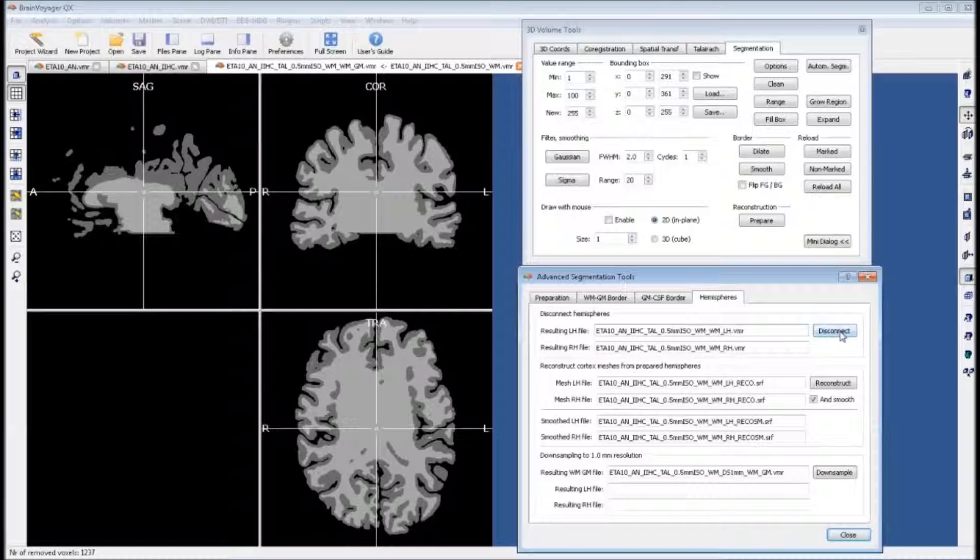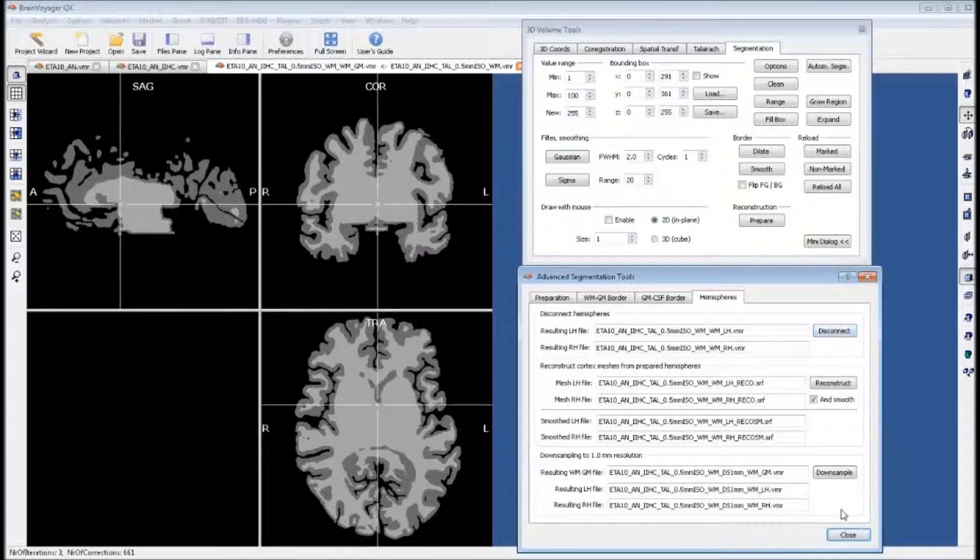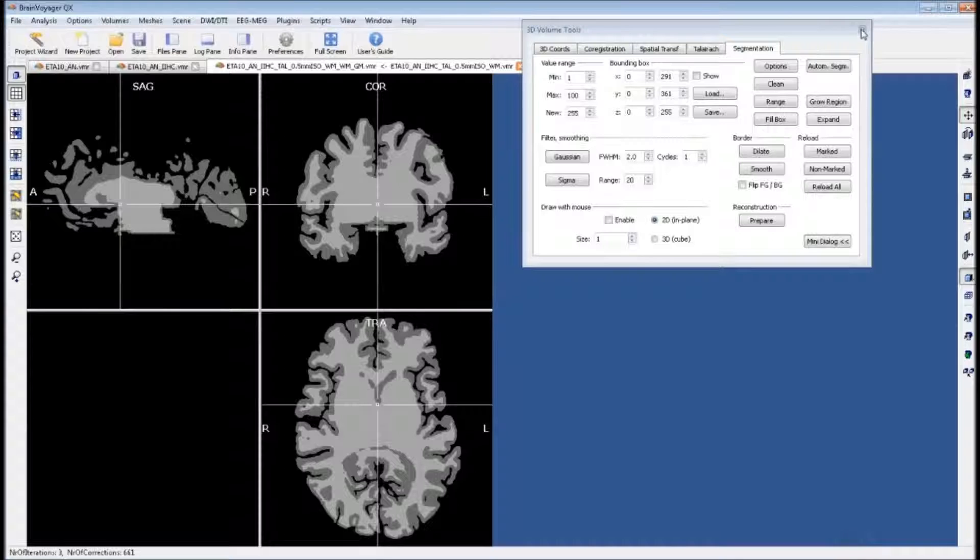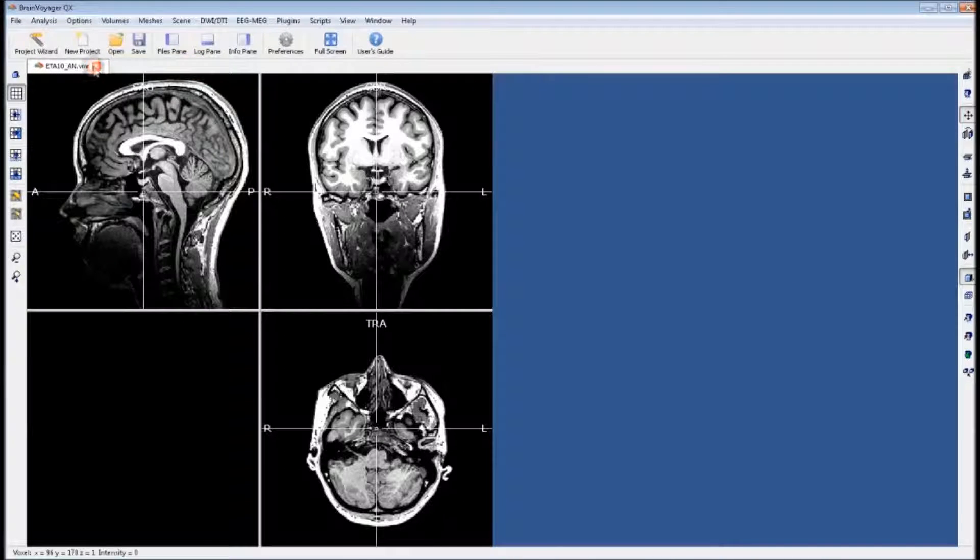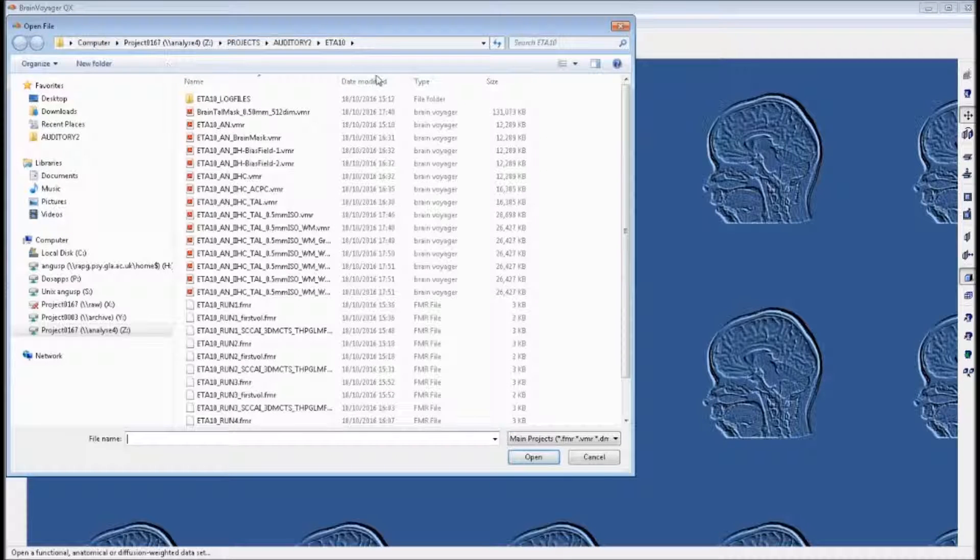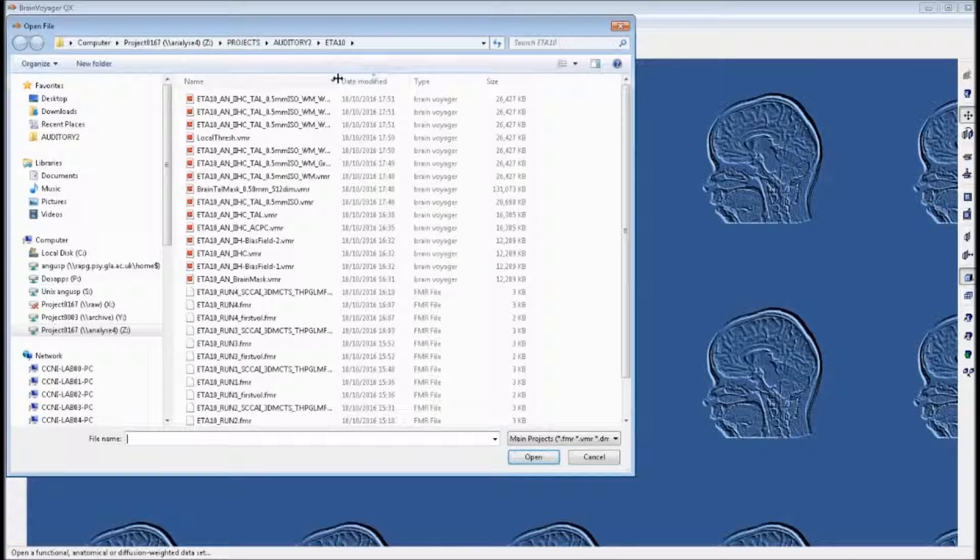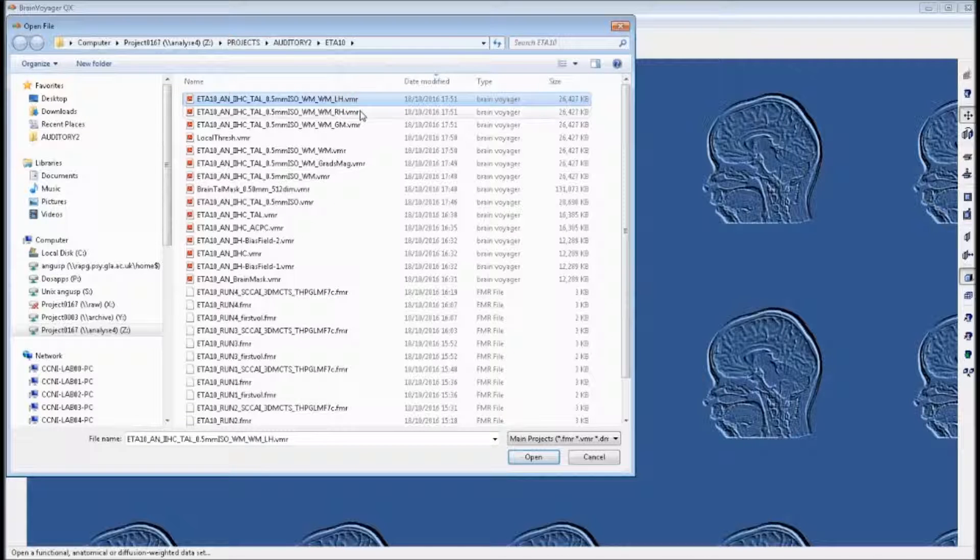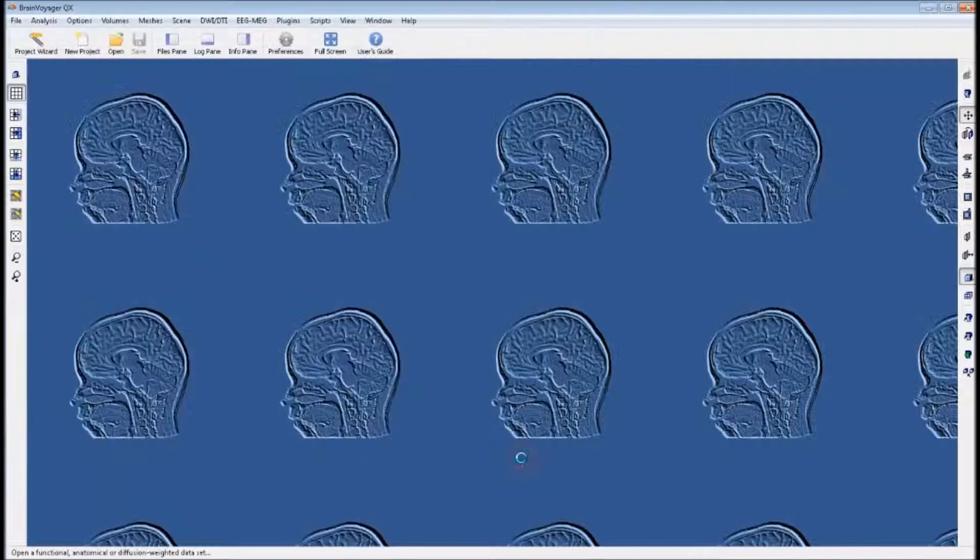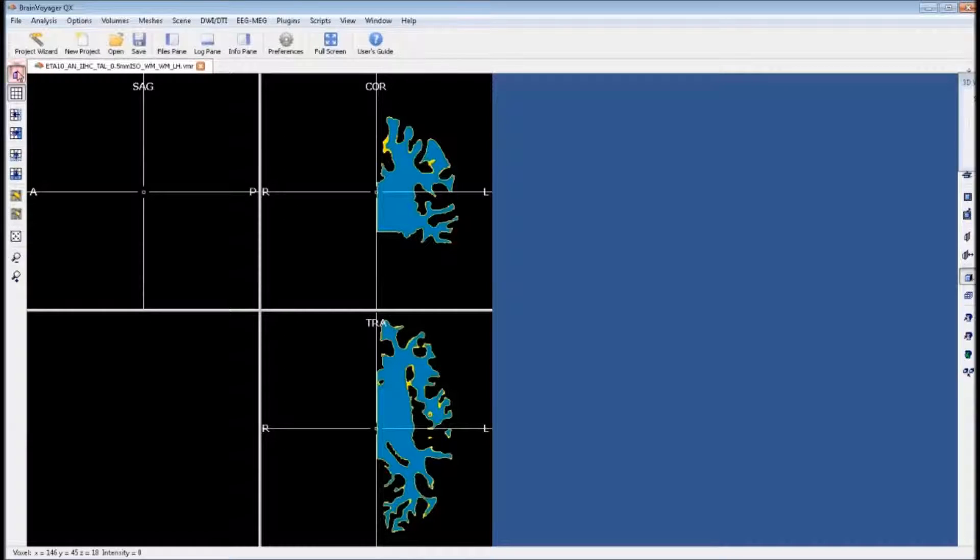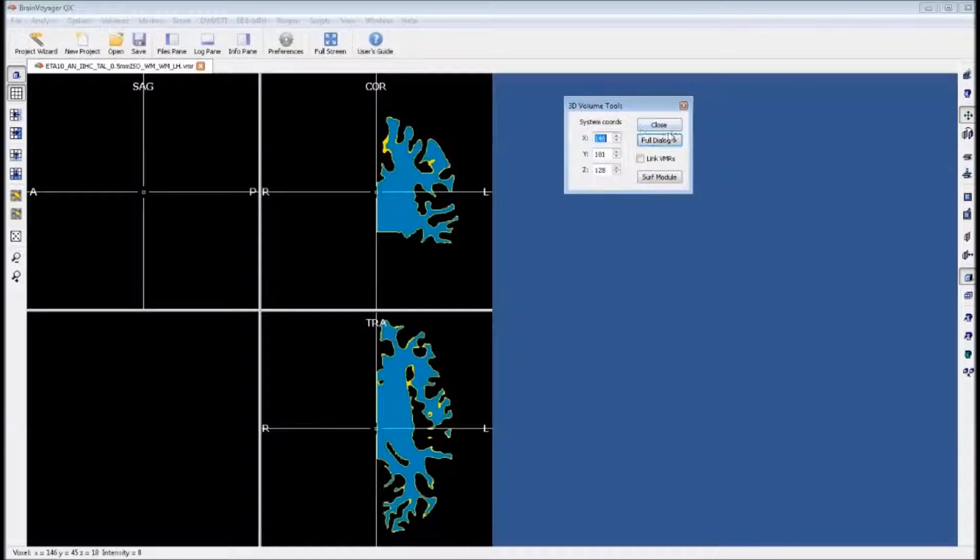We can go to our hemisphere window and click disconnect. This creates both a left and right hemisphere VMR. We can close our windows and close the tabs we've been working on. If we go to open, we can see that Brain Voyager has created both the left and right hemisphere VMR. We can open up one of these, the left. And it looks something like this, this blue brain with yellow border.